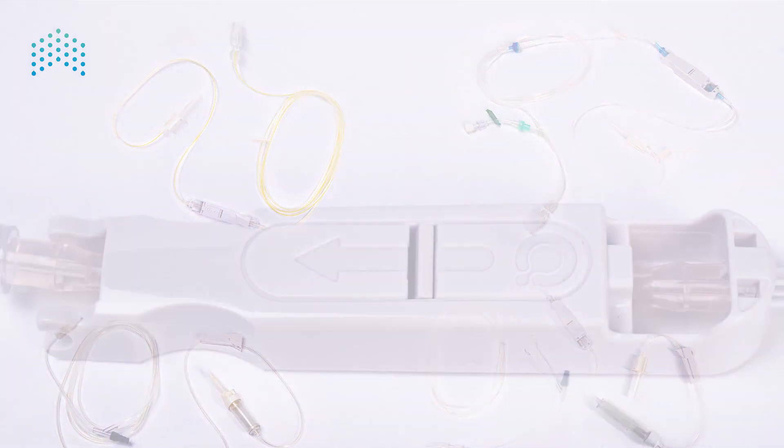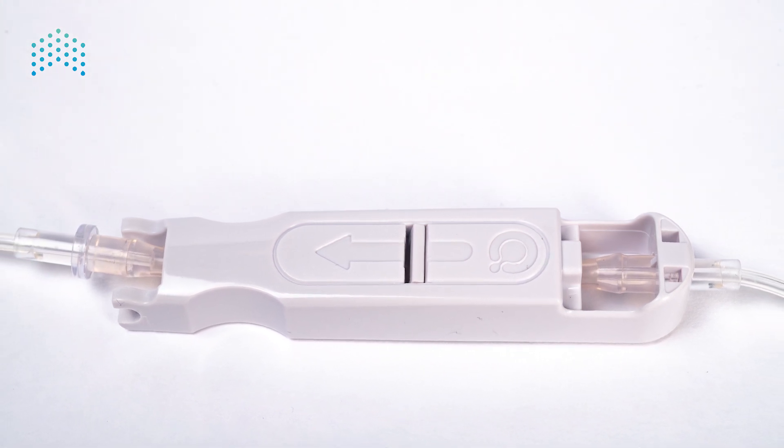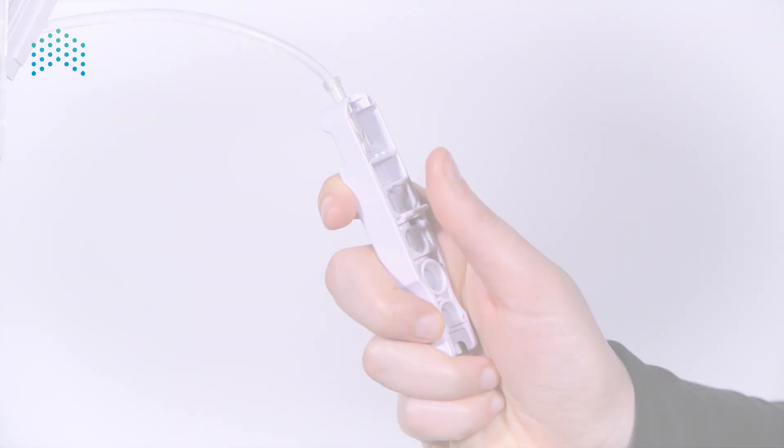Administration sets — the sapphire system includes a wide variety of administration sets accommodating the clinical uses indicated for the sapphire system. Each administration set includes the sapphire cassette with anti-free flow valve (AFFV). The anti-free flow valve protects against free flow and enables manual priming and gravity infusion of most sets.